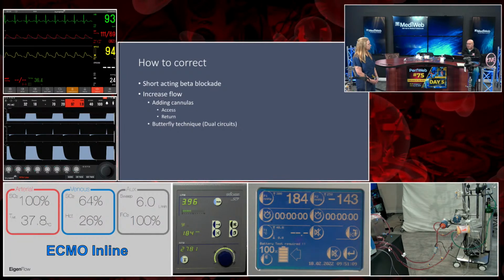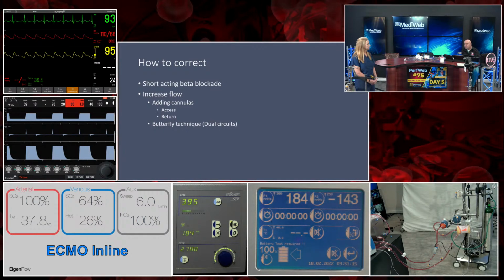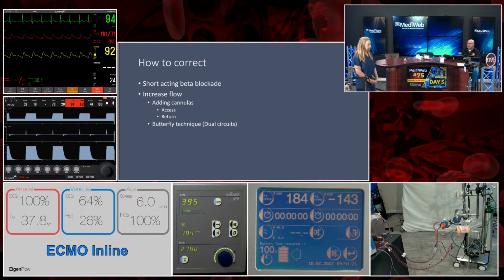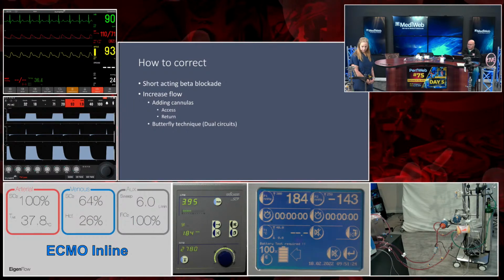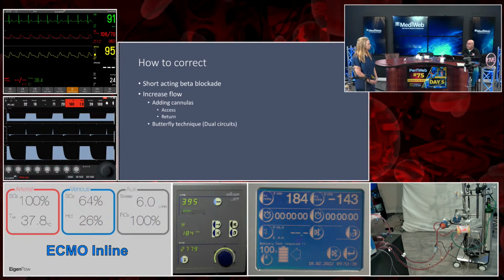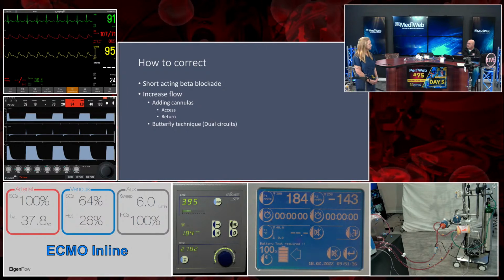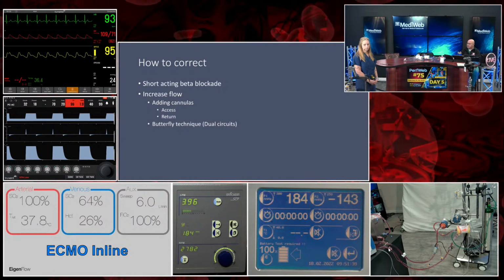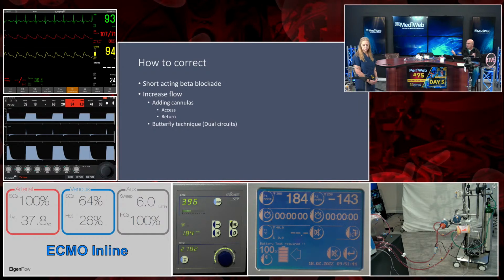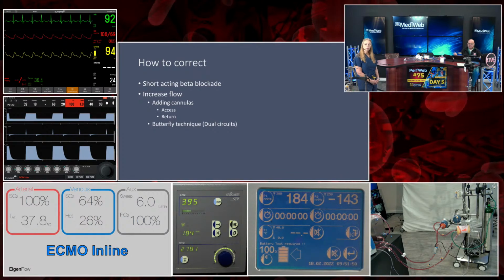And I say this all of the time jokingly, but I'll say it again. I don't think much of the company Baxter Gambro, but they have a really good tool. And their tool, unlike their competitors, I won't even say the competitors' names, is well designed to operate in that hostile environment and do so in an effective way. So I do prefer that as a widget. I think it's an excellent device and works very, very well compared to the other devices that exist out there. So here's our patient looking a lot better, much more stable.